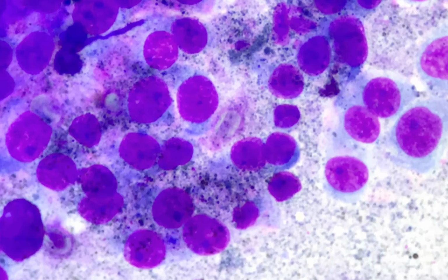So in order to differentiate whether it is amelanotic melanoma or plasmacytoma, you need to do immunohistochemistry and you need to use the cell marker S100 to differentiate between amelanotic melanoma and plasmacytoma.